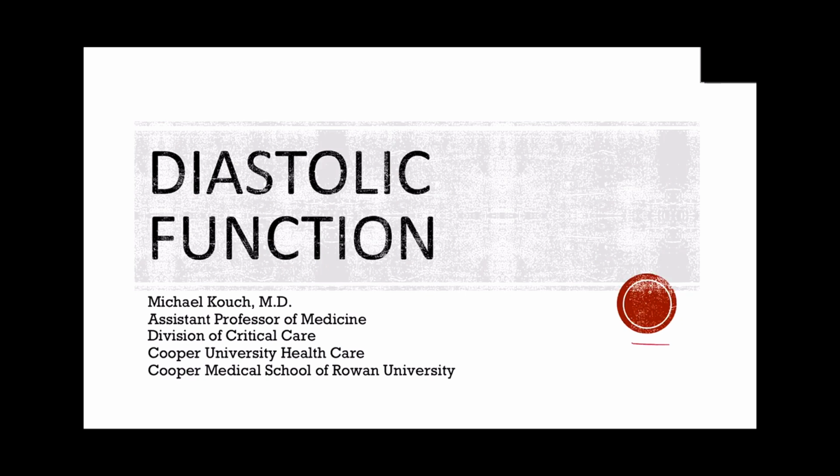All right, so diastolic function. This is a really interesting topic. 50% of heart failure is diastolic heart failure. It's not just decreased systolic ejection fraction. And diastolic function can be very helpful for a couple of reasons.